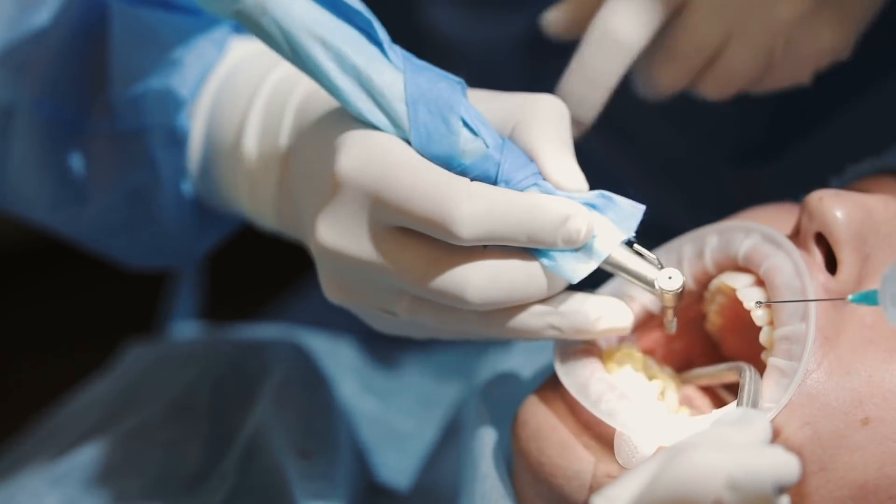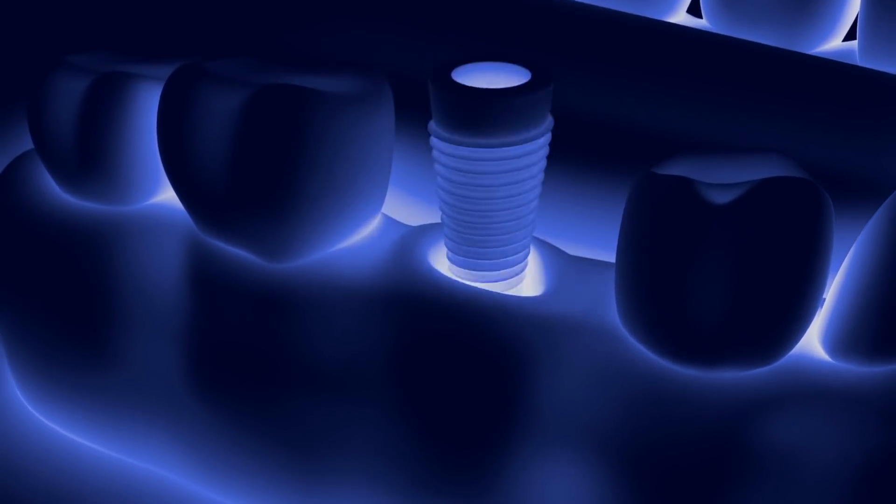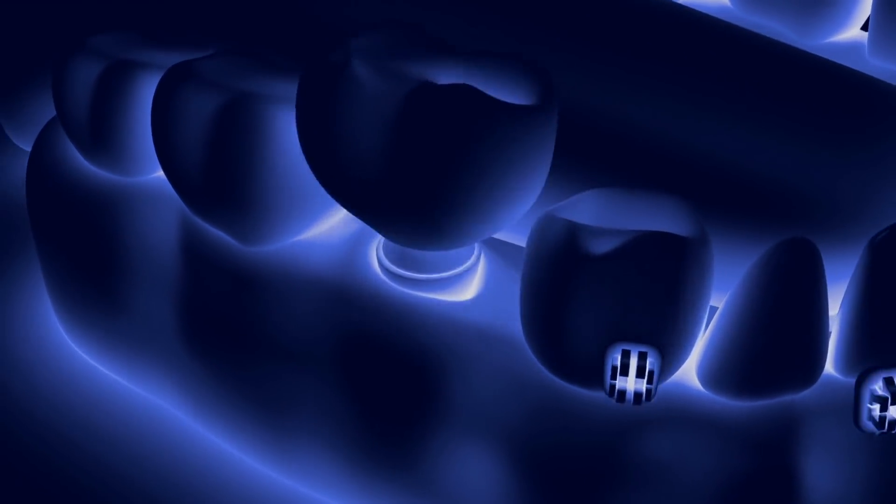The most cutting-edge, advanced, and conservative way of treating the space created by a missing tooth is by using something called a dental implant. A dental implant is a piece of titanium that's screwed into the bone. This titanium is really loved by the body, so your body takes it on as its own. It serves as somewhat of a root to a crown. But a lot of people think the implant is the whole tooth — it's not.